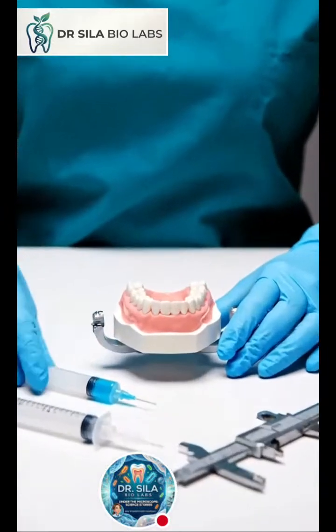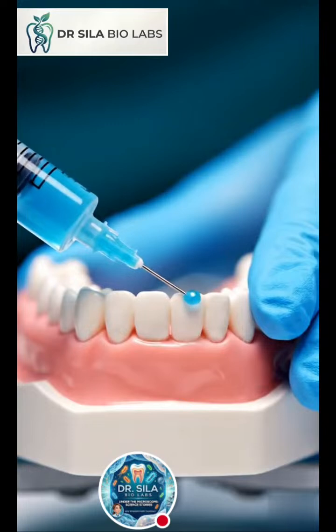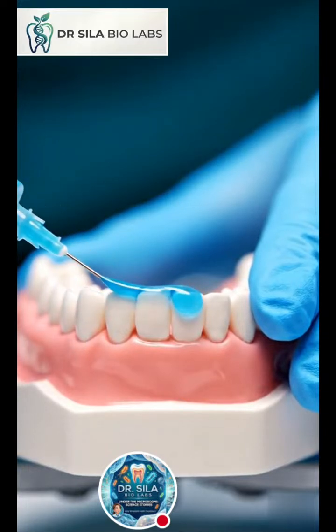We start by isolating the tooth. Then, using the syringe, carefully apply a thin layer of the blue etching gel to the enamel surface.